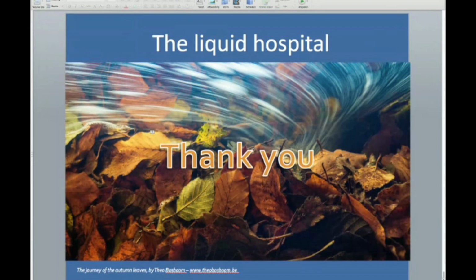Can you have a look at them and tell me your opinion? So that's one possibility. And another way we are using it is, for example, when patients come from another hospital, we can simply download the images into our PACS by using the PACS on web services. Or when patients go to a university hospital, that hospital can also use the same system to download the images. So yes, it's very flexible.